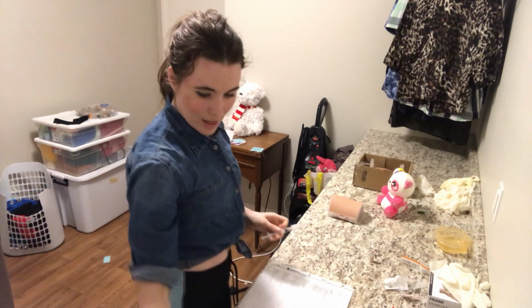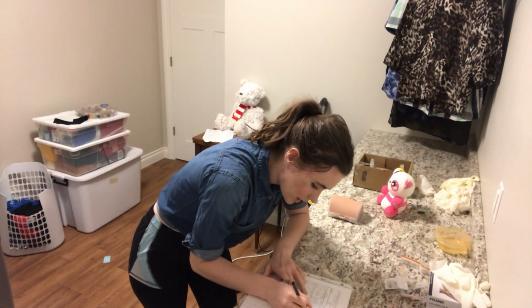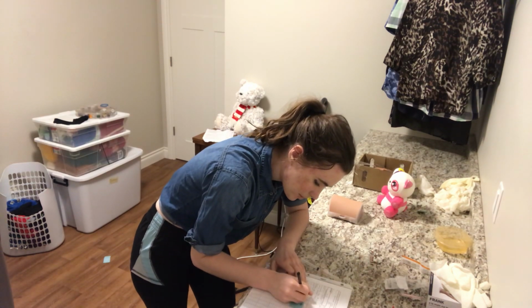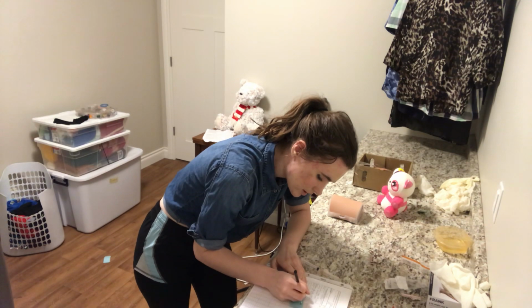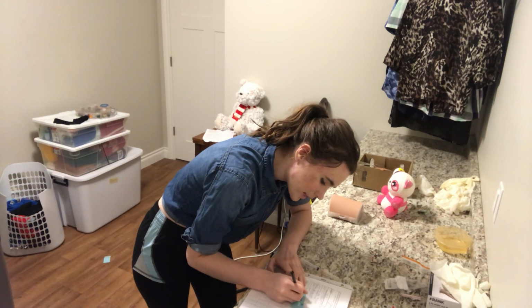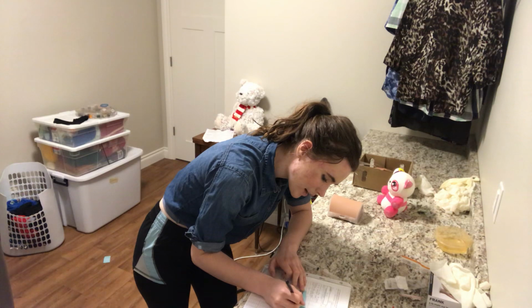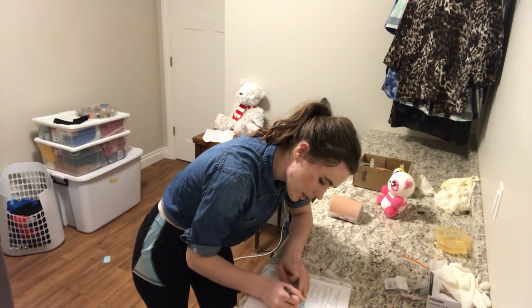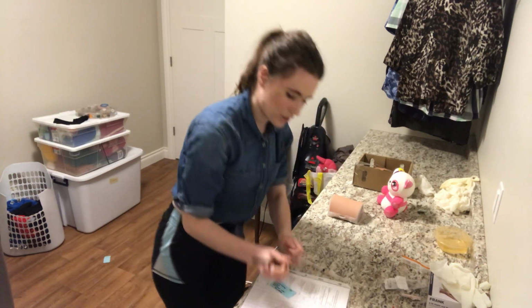So now that I've made that, I'm going to immediately make a med label. So correct patient is Jake Nursing, correct drug is heparin subcut, correct dose is 5,000 units, correct volume is 0.5 ml as we checked with the vial, and the correct time is February 7th, 2021, and it's about 7:45 in the morning. And my name is Melannie Teitsma, Manitoba student nurse, and I am authorized to give this medication at this time.